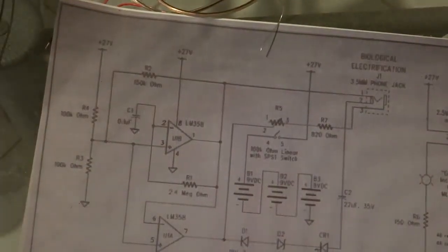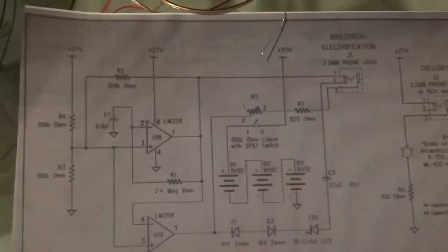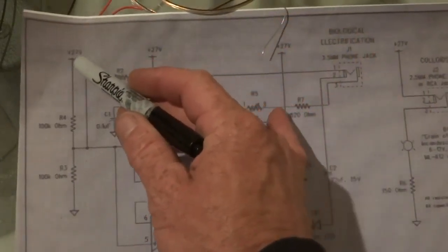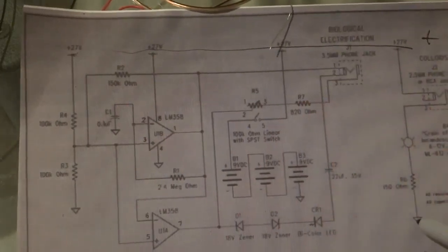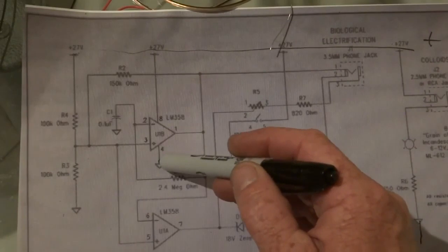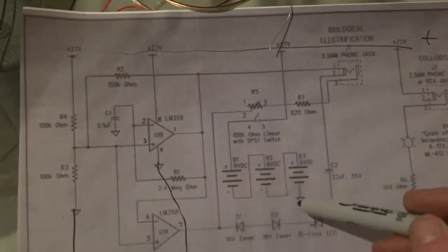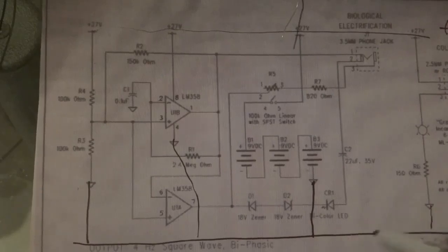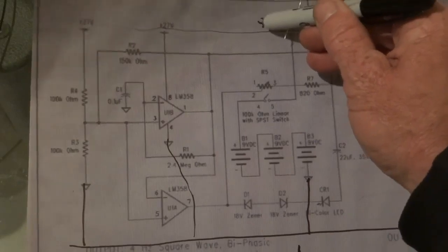Now basically to show you how you've wired this thing: you've got the top positive, this one here is a negative, negative, negative. Off the battery negative — so basically the board: this one here is the negative side, this one here is the positive.